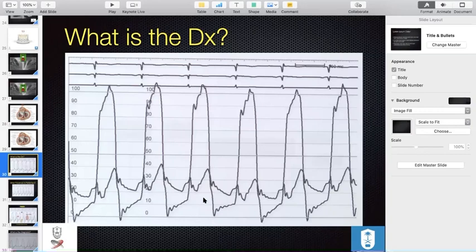So you're not sure, because this always differentiates between atrial versus ventricular. So here it doesn't help me much. So we go to, for each QRS, how many peaks do we have? Clearly you have 2 peaks, right? So we have 2 peaks in each QRS. Okay, so this is going more with atrial. Next, is there an A wave? Well, you're suspecting this is an A wave, you have a P wave in the rhythm. So yes, maybe that's an A wave.